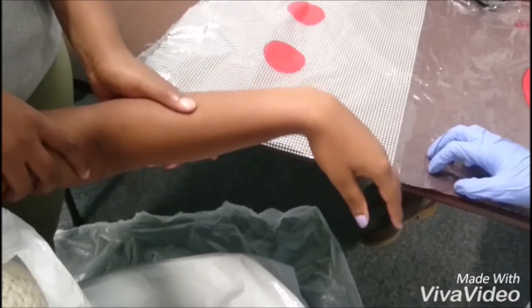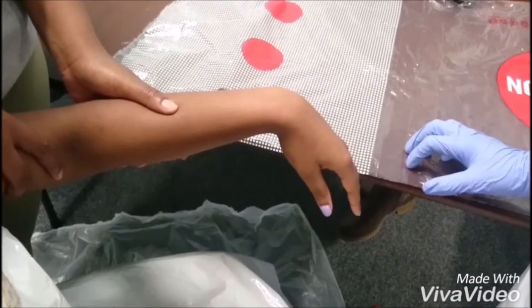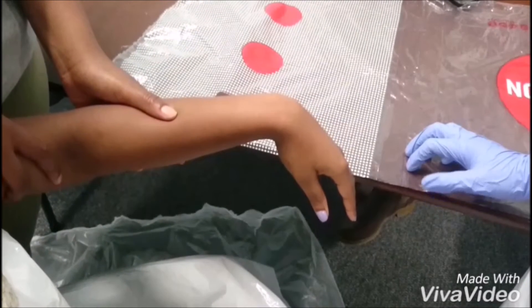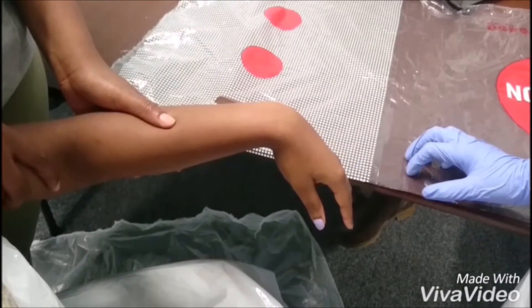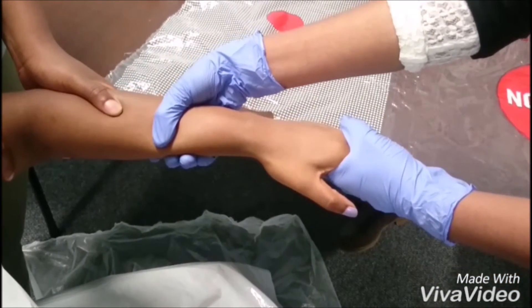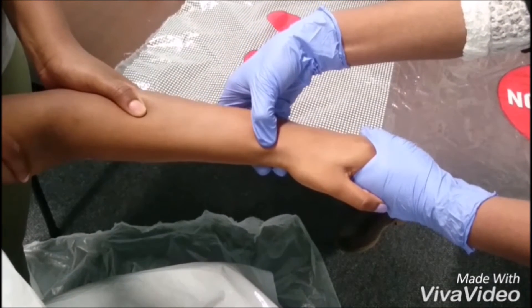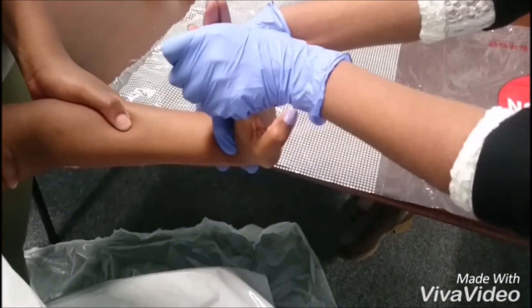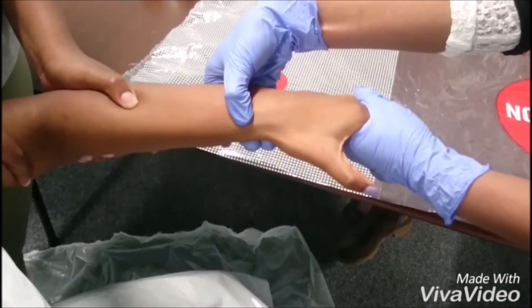Displaced fractures must be reduced under anesthesia, for which we prefer something that acts fast such as ketamine and diazepam. This must be done in a place with fully stocked resuscitation equipment. The hand is grasped and traction is applied in the length of the bone to disimpact the fragments. The distal fragment is then pushed into place by pressing on the dorsal. The wrist is then hyperextended to accentuate the deformity, then moderately flexed and ulnar deviated to 45 degrees.